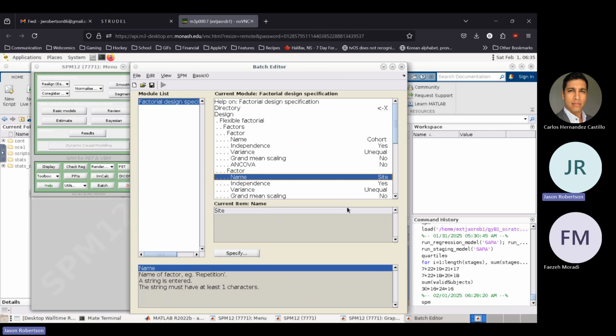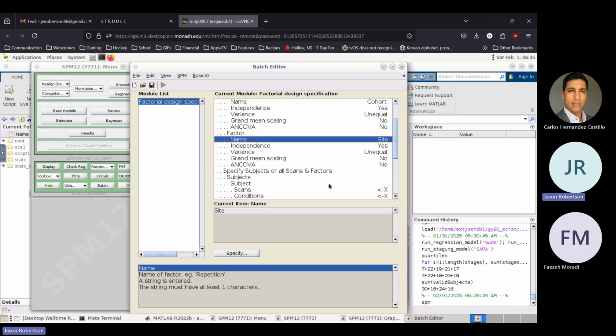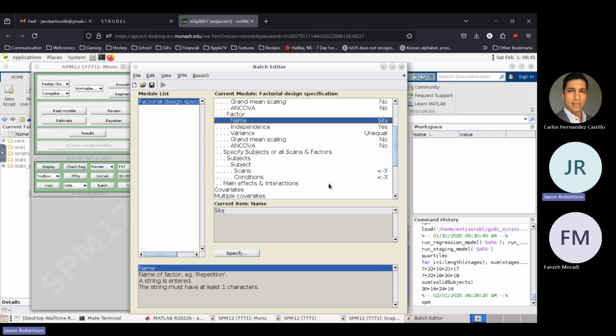I think, from the reading I was doing, T is like the square root of F or something like that. The thing is, depending on the model, you are comparing different things, right? And to my understanding, the F test is also called omnibus because it's basically making all the comparisons as one thing.